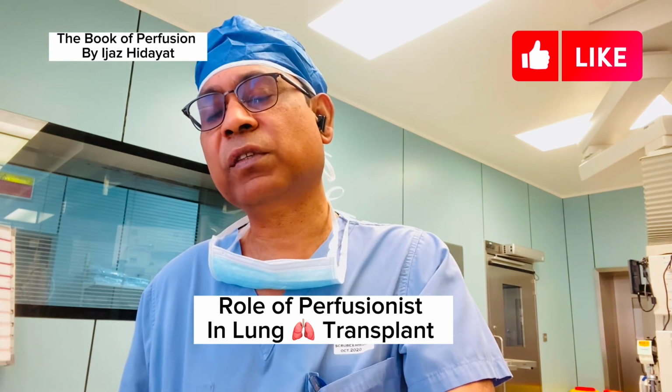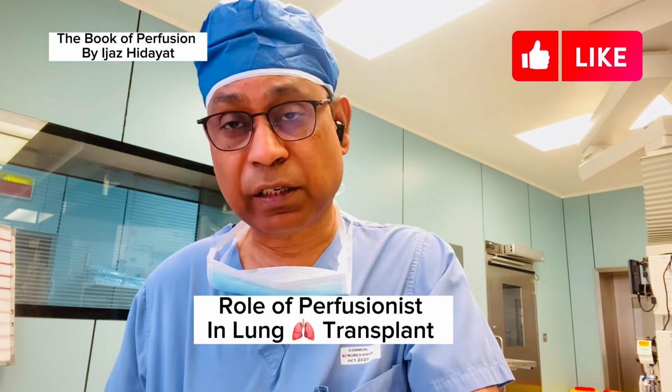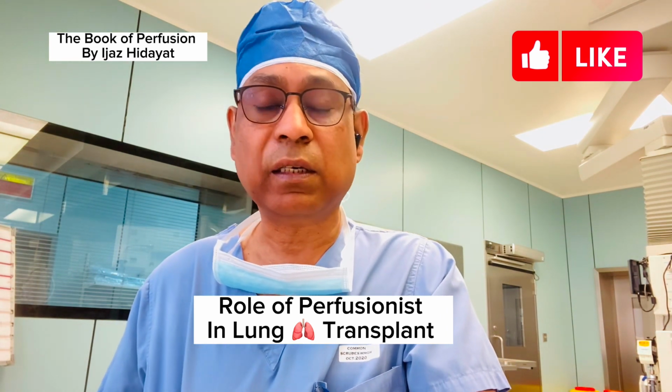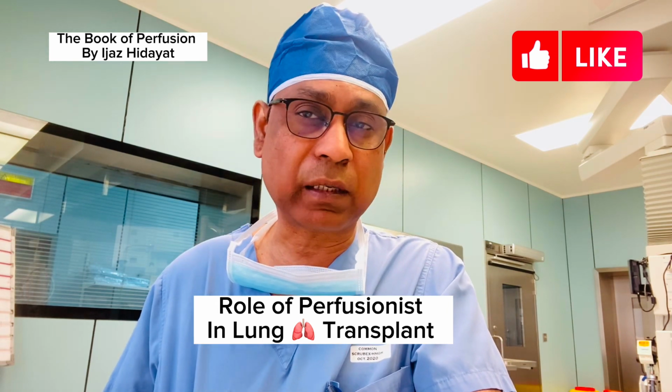So the on-call perfusionist gets a call from our team that the decision has been made for the lung transplant surgery. In a lung transplant surgery, we always keep the cell saver in all cases.